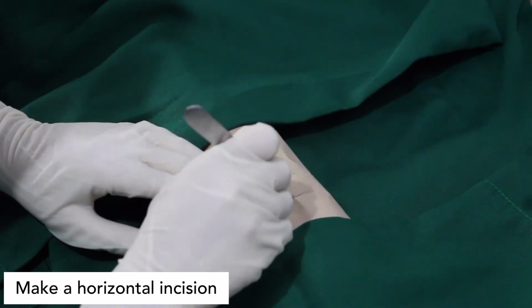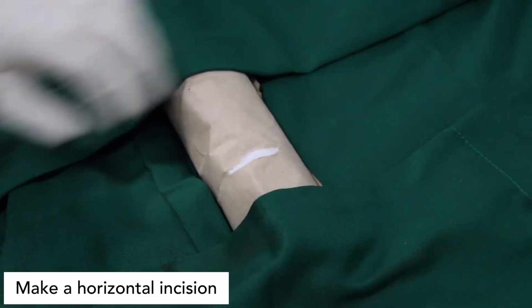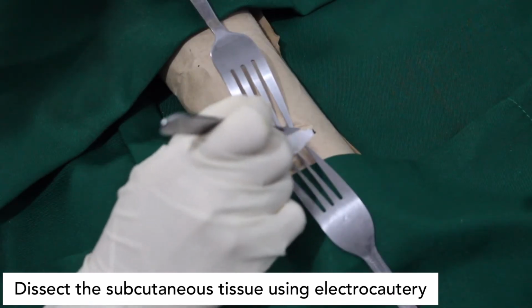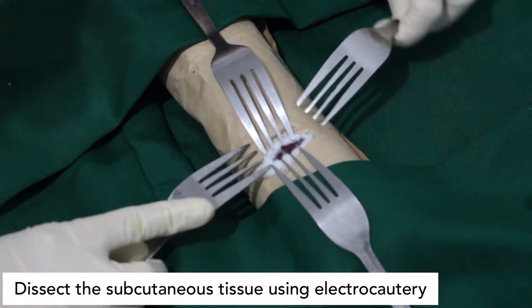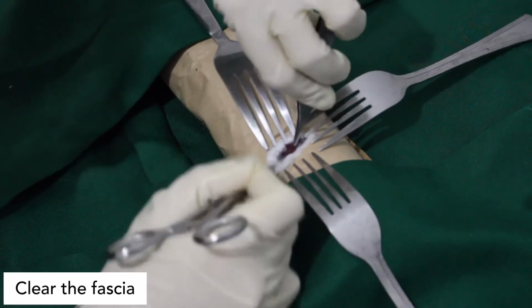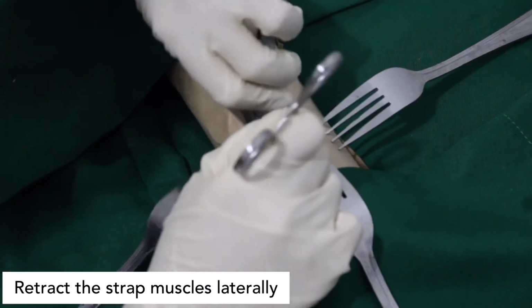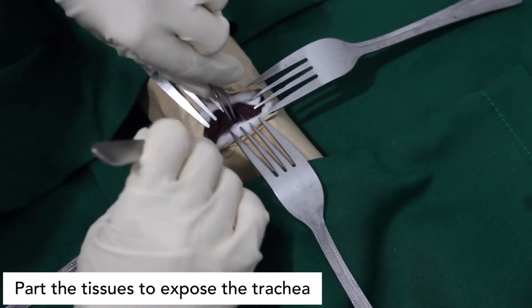Make a horizontal incision in the marked area through the dermis, and the subcutaneous tissue will be dissected with electrocautery. Once the fascia has been cleared away, identify the strap muscles and retract them laterally. Expose the trachea by parting away the tissues.